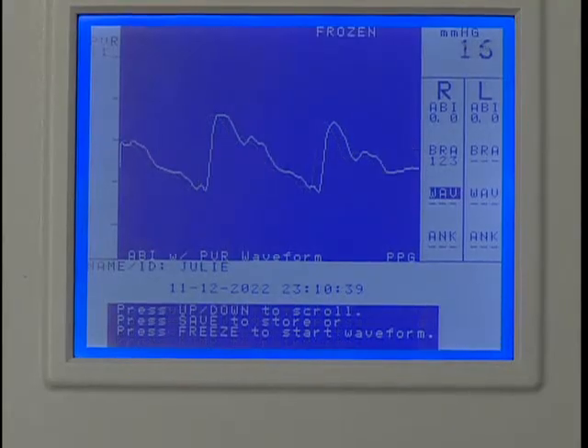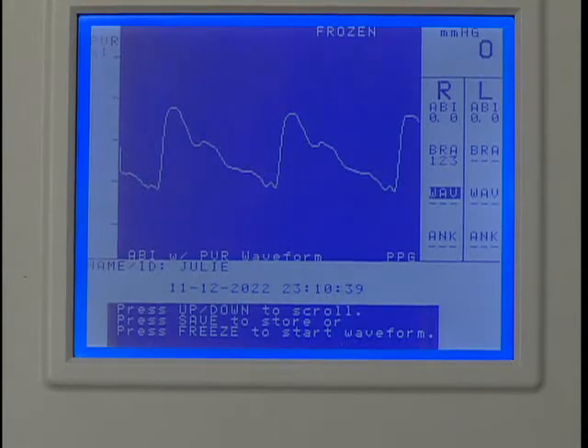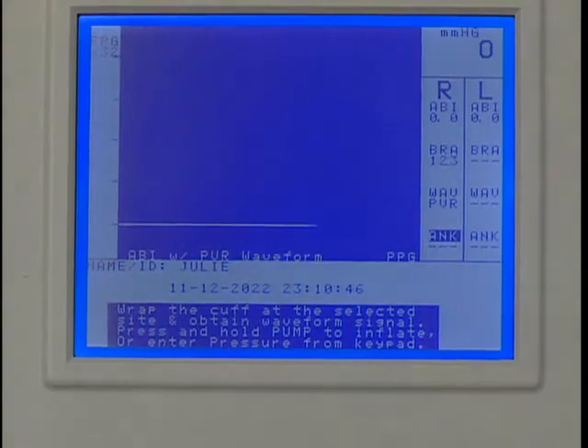Here you have two options. If the waveform is acceptable, press SAVE to record it. Or use the UP or DOWN key to scroll to the optimum waveform, then press SAVE to record it. Press SAVE again to move to the next protocol location.